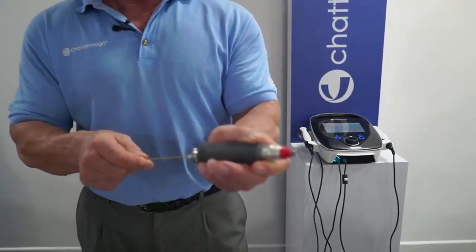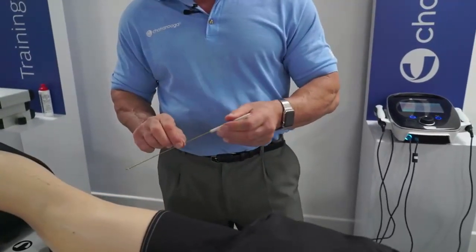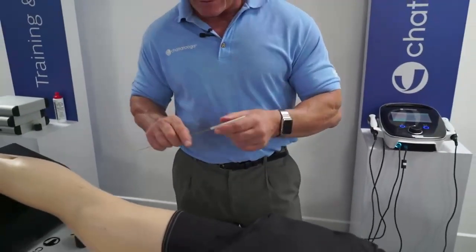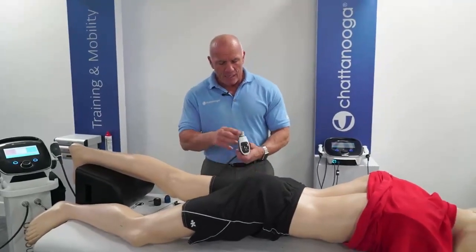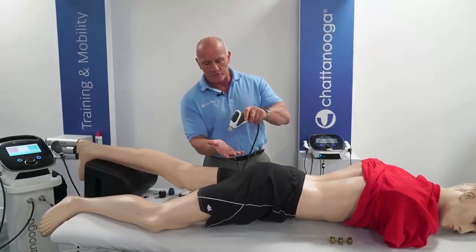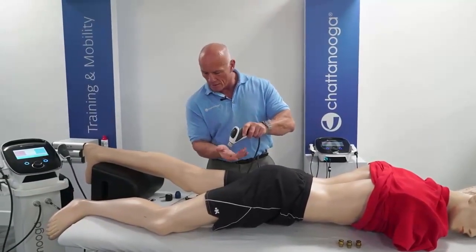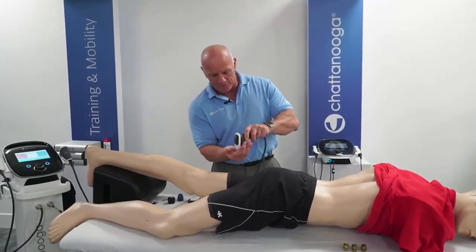Now remember, we've got metal on metal, and the metal will wear. So we're going to build up little iron filings. And in the end here, this is magnetic. So just tap out your projectile, which I've done here.